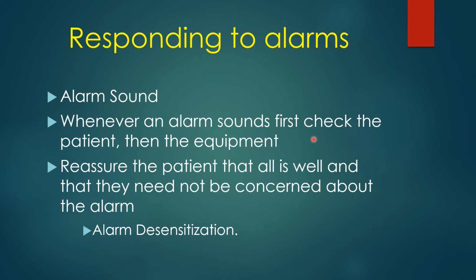And as I walked in the room, I saw that the patient was almost completely extubated. I could see the cuff in his mouth, the tube sticking out, down to his chest. But the alarm was from the ventilator, not the patient. So they were paying attention to the ventilator, and that wasn't the problem, it was the patient. So remember, start at the patient and work toward the ventilator.